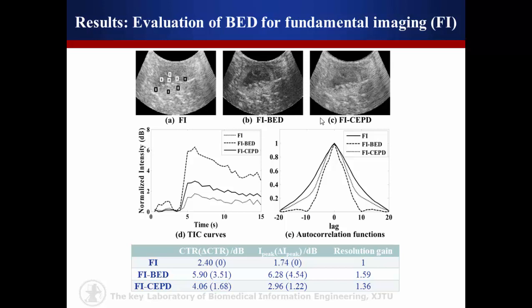All the quantified parameters were listed in this table. For FI, both CTR and the resolution were improved by deconvolution, and FI-BED performed better than FI-CEPD in both CTR and resolution.